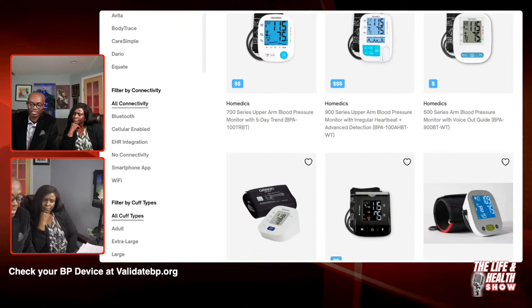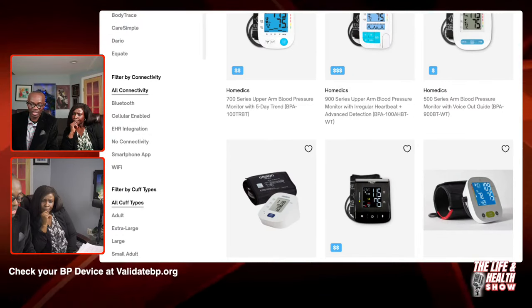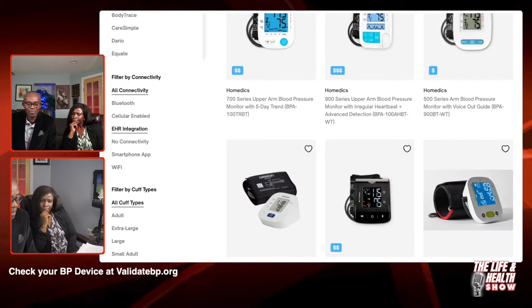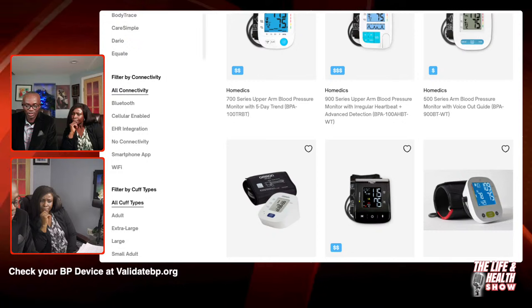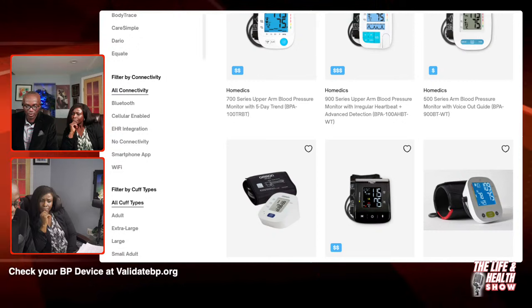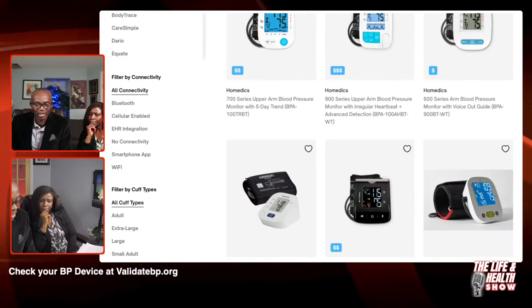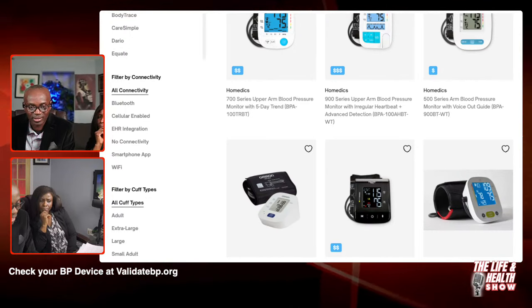Now, even though this machine is here, this is a wrist one, we do not support the wrist one. So even though they have validated this, if you have to use a wrist machine for whatever reason, maybe you have arm pain right there and you can't do anything about it, then of course you could use that one. But apart from that, we would say don't use that one, because obviously it is not the best. We have already told you we want something that is far better than just the wrist one. We all know that the wrist one is not the best, right? And also, there are several other brands that we can see on there.